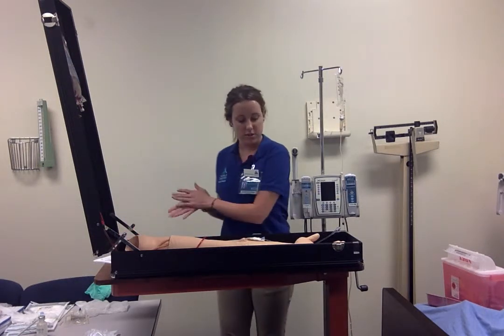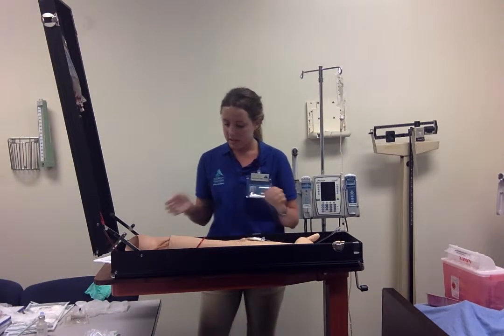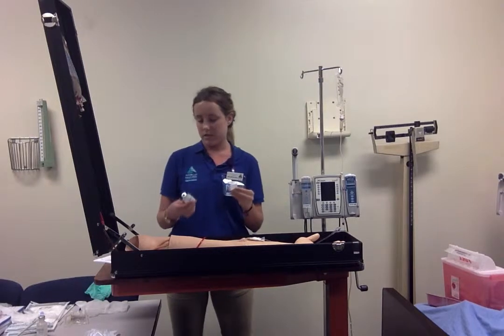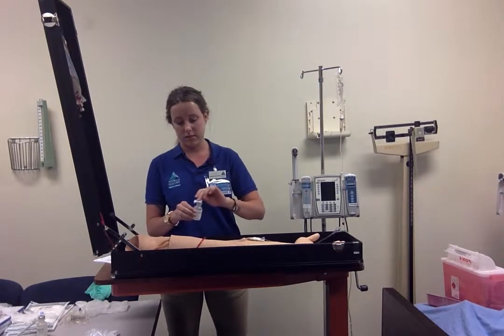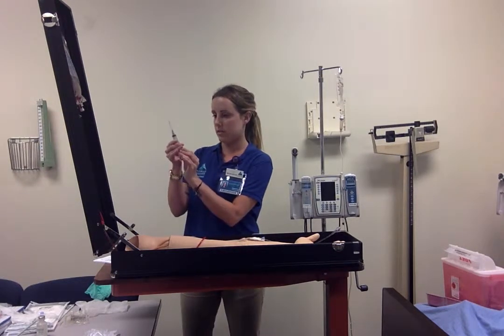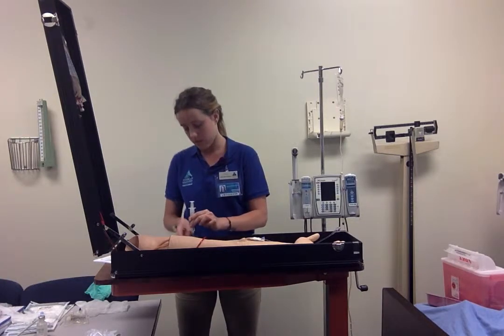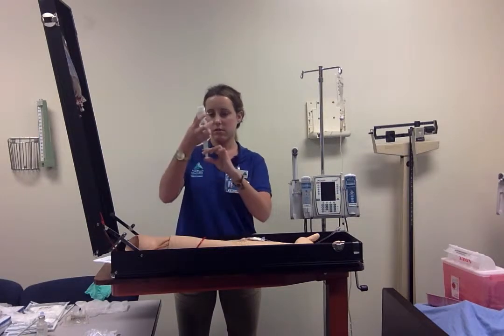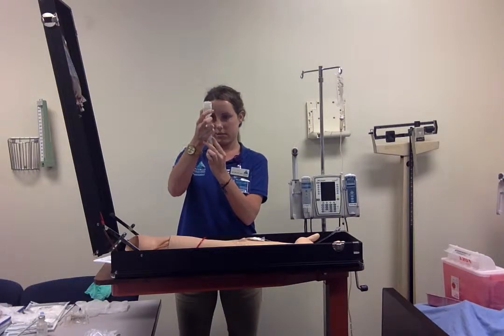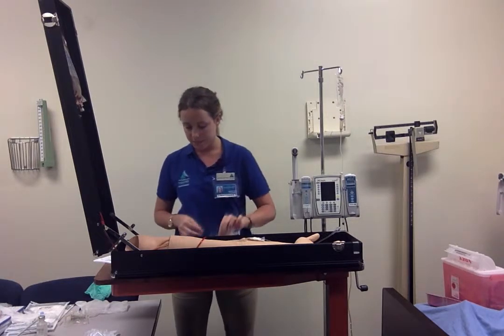So first I'm going to make sure my hands are clean, and I'm going to get the medication ready. I'm going to clean and double check my Rocephin and expiration date. I'm going to clean, and I'm going to pull back 2 milliliters and inject the 2 mils of air. Alright, we have 2 mils. I'm going to recap.